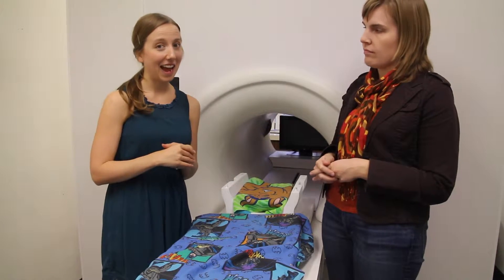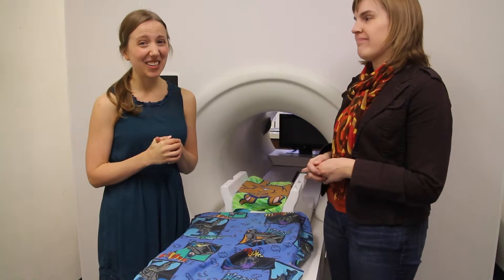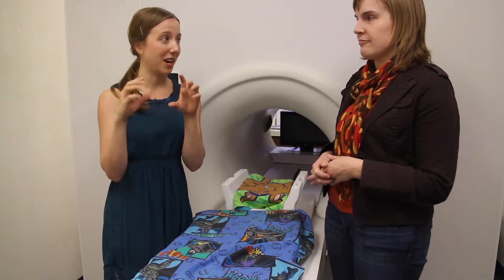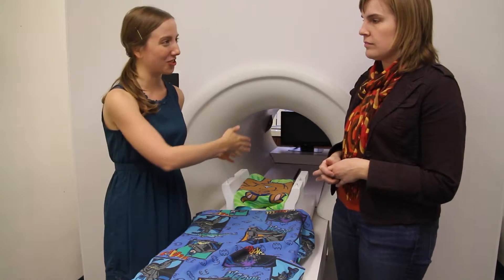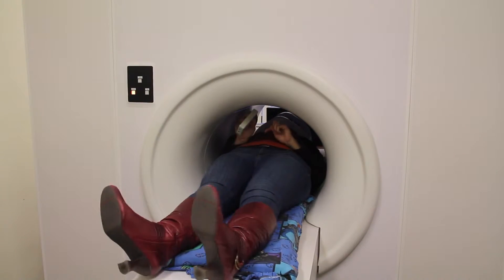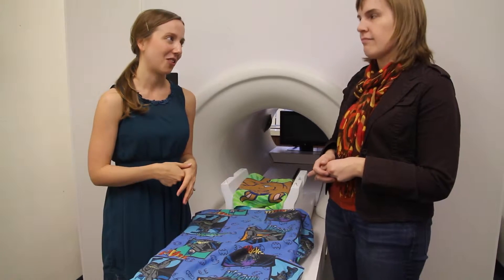The last thing is moving. You have to hold really still to get nice MRI images of the brain. We tell kids the MRI machine works kind of like a really old camera — if you take a picture of someone who's running with an old camera, they usually come out blurry. Same thing happens in there if you're moving your head around; all the images of your brain are so blurred that we can't really see anything. So we watch children when they're in there — we watch their legs, we try to watch what their head is doing, and give them feedback about trying to hold still. For some kids that's easier, and for some kids that's harder.